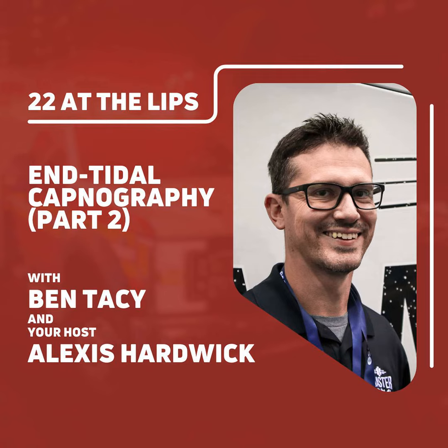And then one of the biggest things, and one of the first places we saw capnography used, is confirmation of endotracheal intubation or advanced airway placement. That was the gold standard of why it originally came out, to confirm as another device that you were getting a direct reading from CO2, meaning your tube's in the lungs, you're getting gases there. No CO2 comes out of the belly. So if you're in the lungs, you've got a reading. Okay, cool, we got a number.